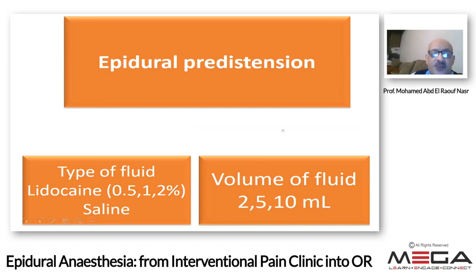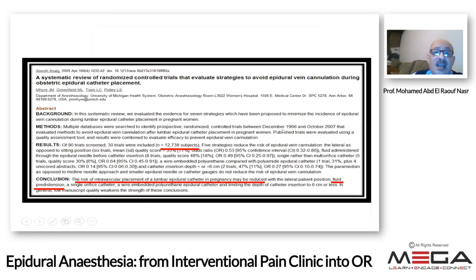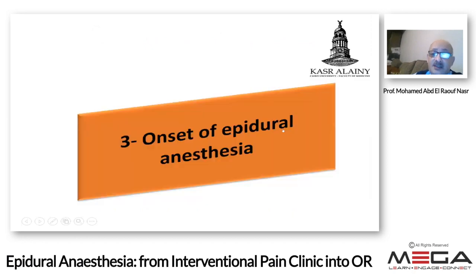Personally, I put 3 milliliters of lidocaine, add to it 3 or 5 milliliters of saline, and I predistend my epidural space in every case. And a lot of publications show the value of epidural predistension and its advantage.